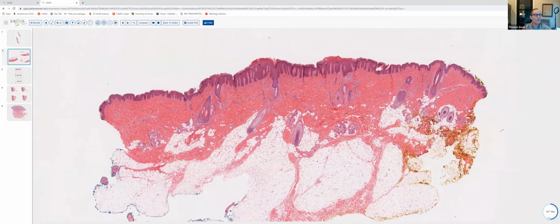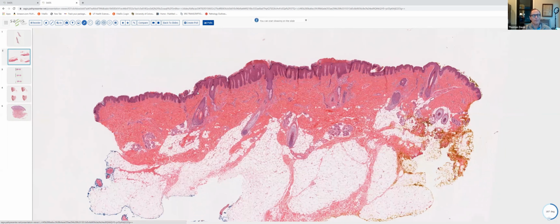If we focus on the central portion of the specimen, we can see we have a fairly sharply circumscribed zone characterized by epidermal hyperplasia and papillomatosis. And what, of course, is characteristic of lesions of ILVEN are the alternating zones of full thickness parakeratosis in the stratum corneum and compact or basket weave ortho.